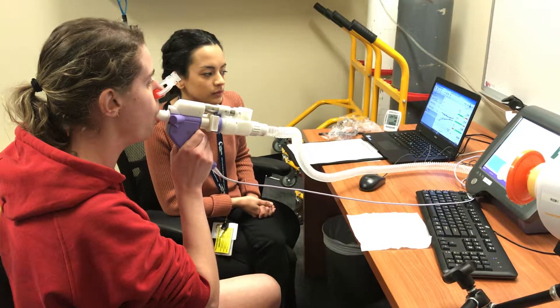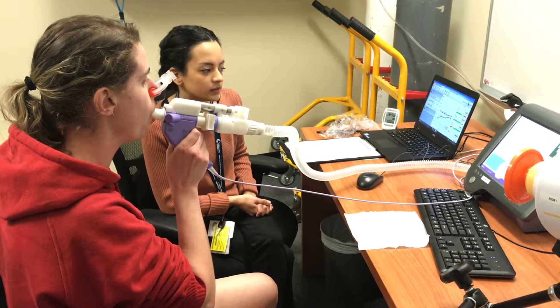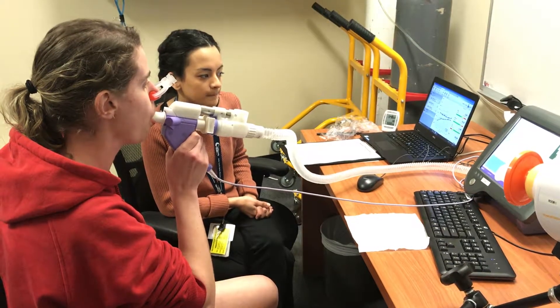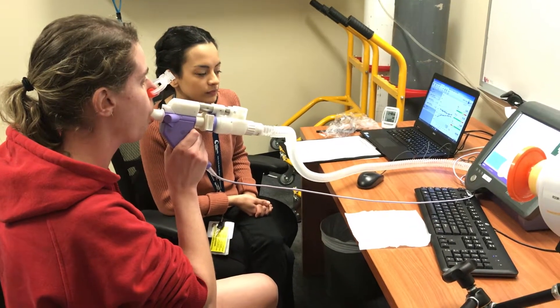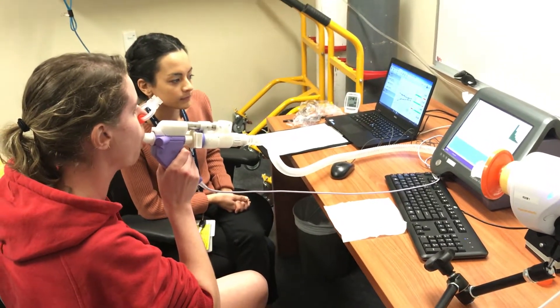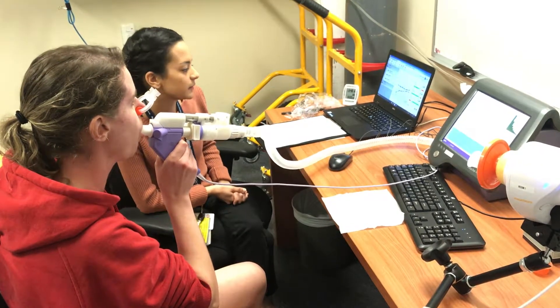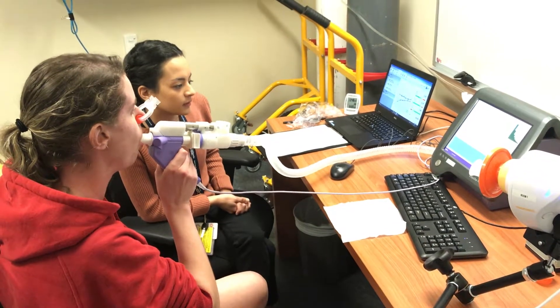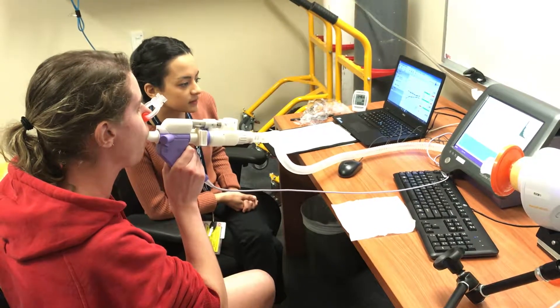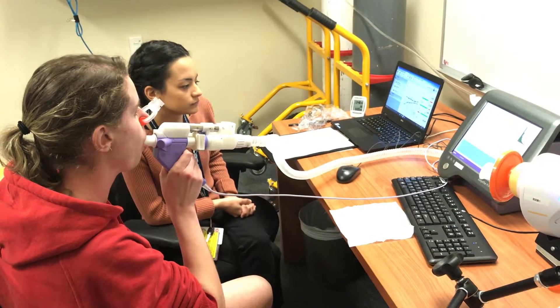Good. Doing well. Just making sure you're empty before that next breath in. Beautiful. Doing really well. And doing very well.